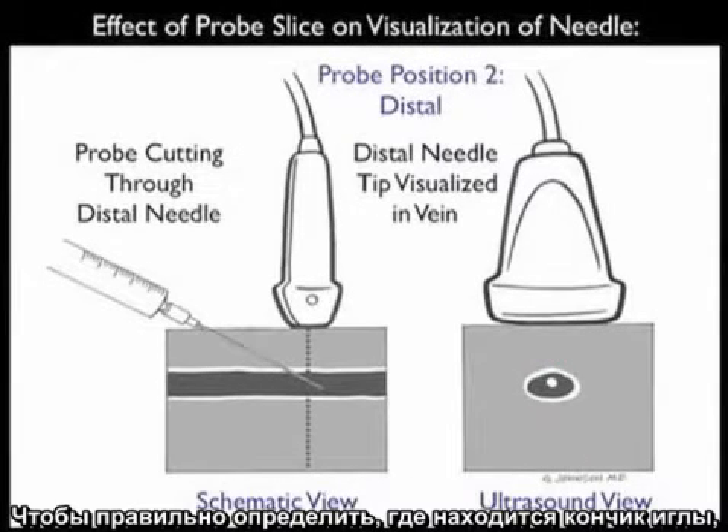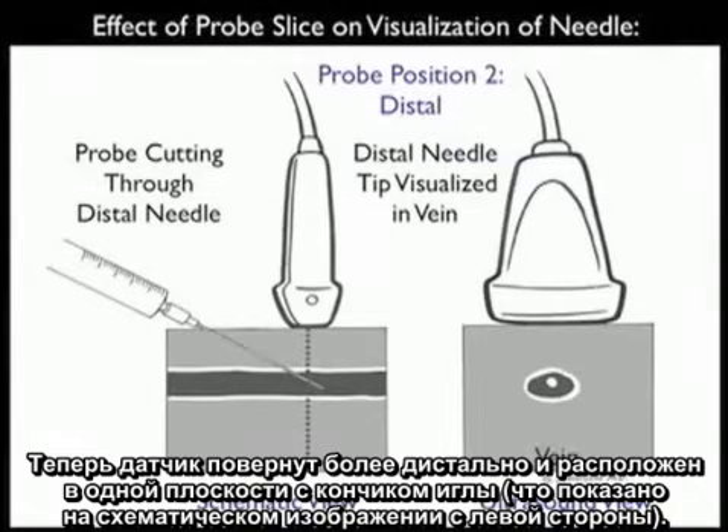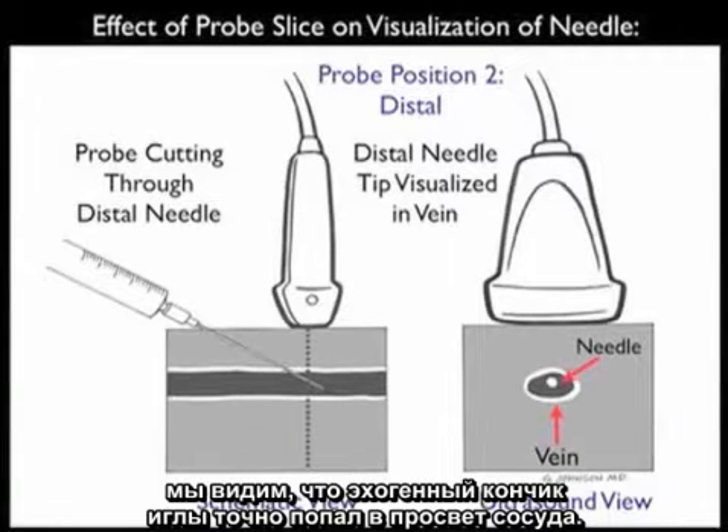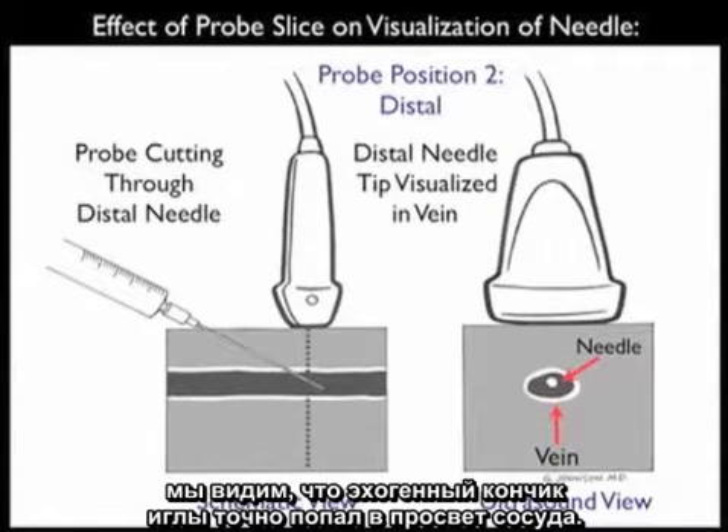In order to accurately determine the location of the needle tip, we need to move the probe more distally as we advance the needle into the patient's neck along the course of the vessel. Here we see the probe positioned more distally, now in plane with the needle tip in the schematic view towards the left. There we can get an accurate determination of the location of the needle tip with regard to the venous lumen. In the ultrasound view towards the right, we'll now be able to see the echogenic tip of the needle accurately positioned within the vessel lumen.